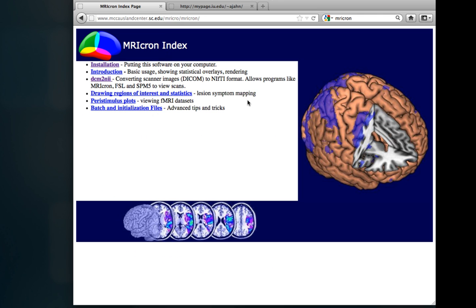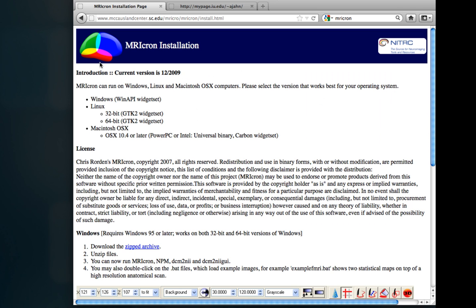MRICron is a suite of packages which includes a converter called DCM to NII, which stands for DICOM to NIFTI. In order to install DICOM to NIFTI and the rest of the tools in MRICron, just click on the installation link and follow the instructions according to your computer platform.